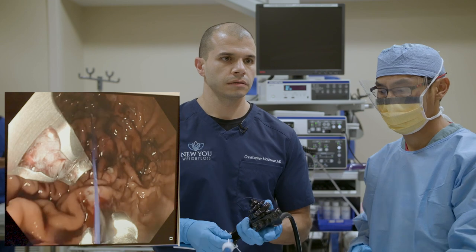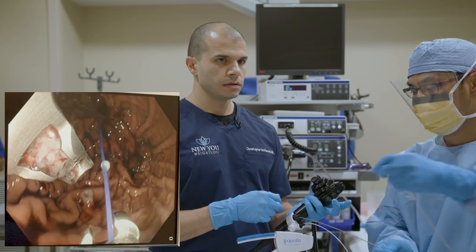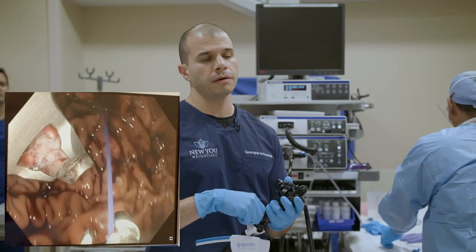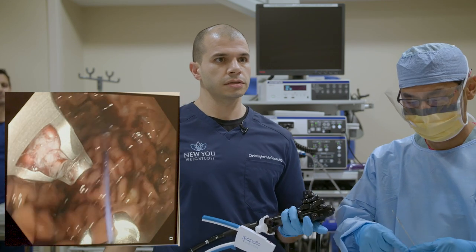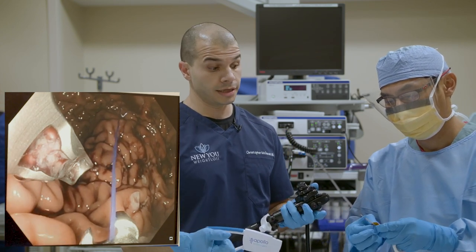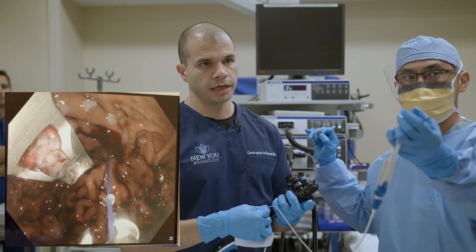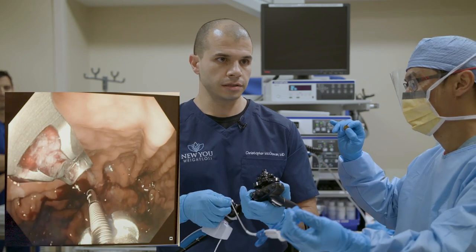Question from Kim: is this a long-term or short-term procedure? This is a long-term procedure. The longest data we have are five years from Cornell and Dr. Shariah, which showed maintenance of weight loss for five years. A lot of it boils down to technique — making sure all sutures are placed appropriately and full thickness, and then it should last. Of course, weight regain can occur after any weight loss procedure. We can also revise previous gastric bypass or surgical sleeves using this device where weight has been regained, to make them tight again.